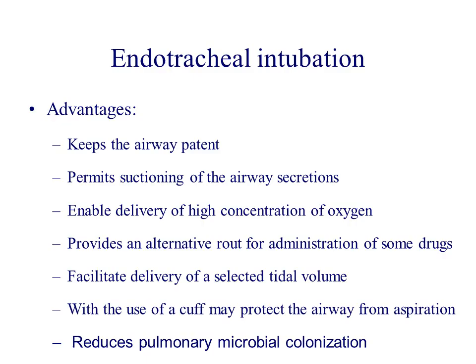The advantage of endotracheal intubation is that it keeps the airway patent and prevents any airway obstruction. Also, it permits suctioning of the airway secretions, removing the secretions from the airway easily, especially for patients unable to cough. It enables delivery of a high concentration of oxygen. It's a preferred method to provide a high concentration of oxygen, better than the nasal cannula or the face mask, because we also ensure that an accurate amount of oxygen is delivered to the patient.